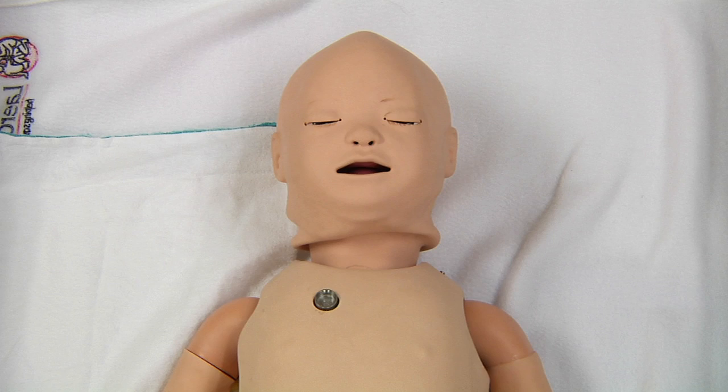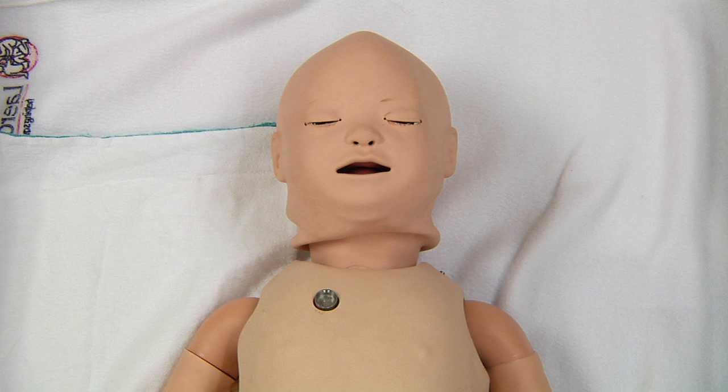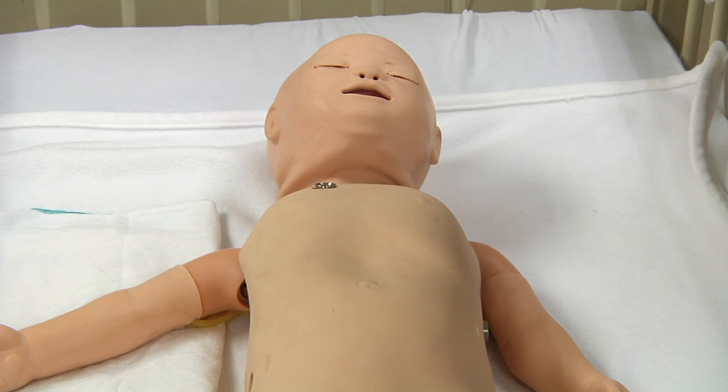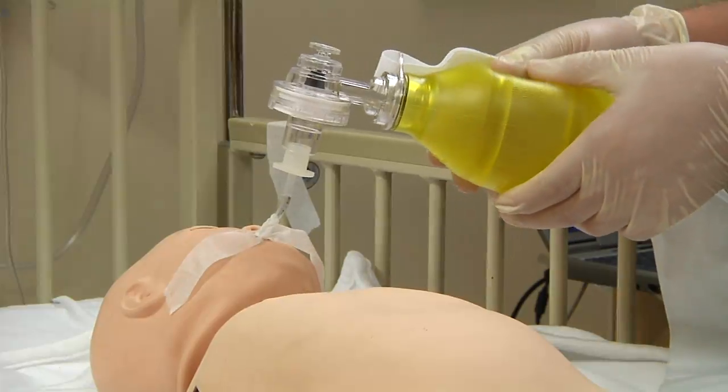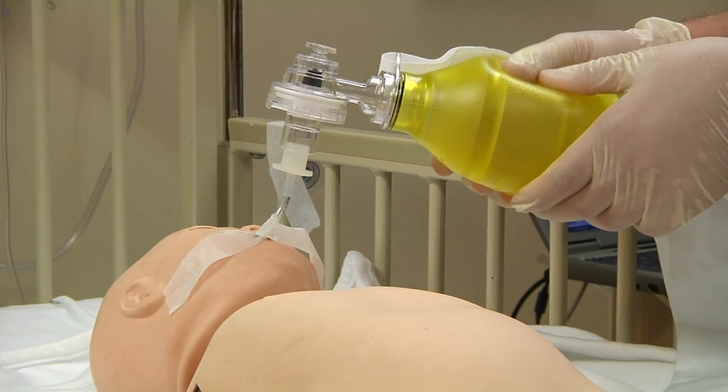The mannequin may present with tongue edema, pharyngeal swelling, or laryngospasm, and failure to properly place an airway may result in right main stem intubation with unilateral chest rise, or stomach distension. Seesaw respirations and retractions may also be visible. You may also experience variable lung resistance and compliance when ventilating.